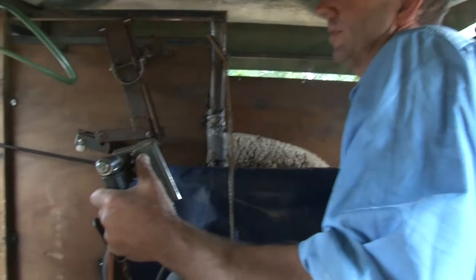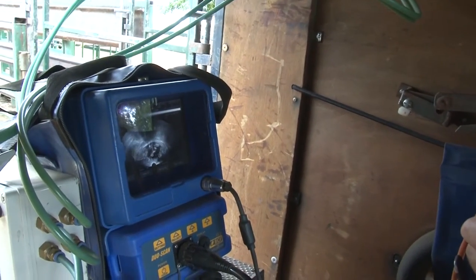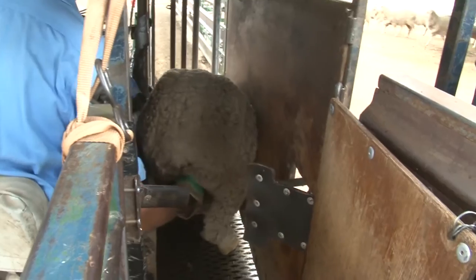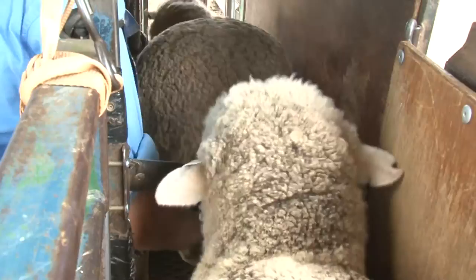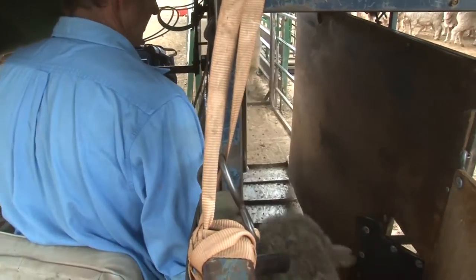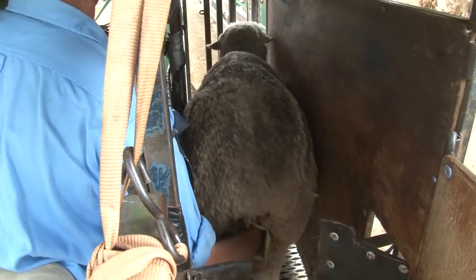Once again, in with a nice bit of contact, scan from the back, through the foetus, through the uterus, out the other end. Nice single. Once again, contact on the center — the center is dangerous — and we've got a single. Another single.